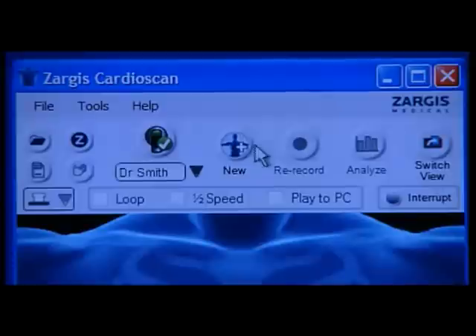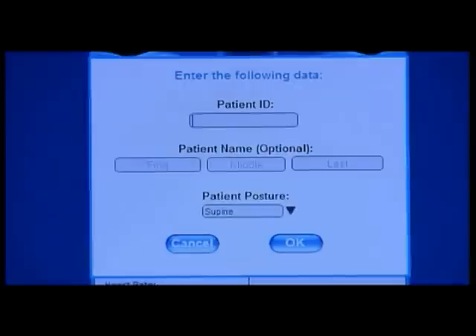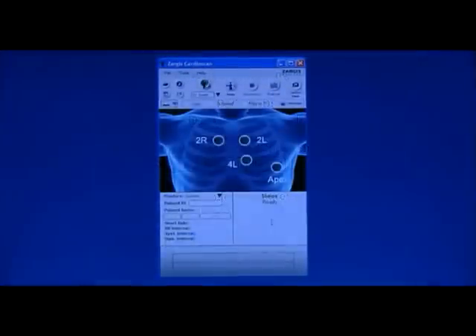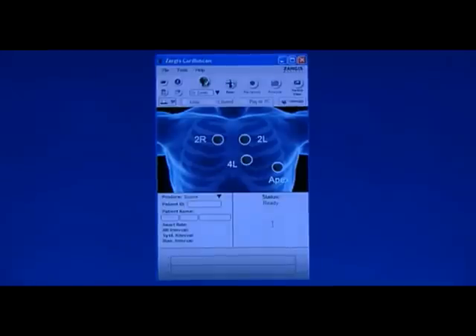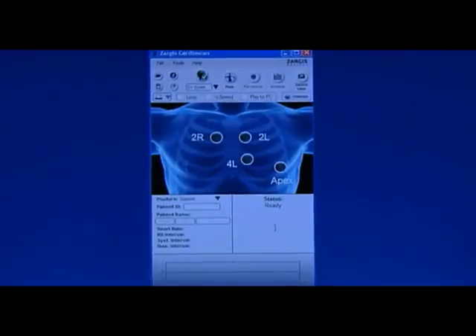Start a recording by clicking the New button located on the center top of the screen. A recording setup screen will appear. Enter the patient ID and, if desired, enter the patient's first, middle, and last name. Select the patient's posture. To use the Zargis CardioScan software diagnostic support capabilities, a specific recording routine must be followed.